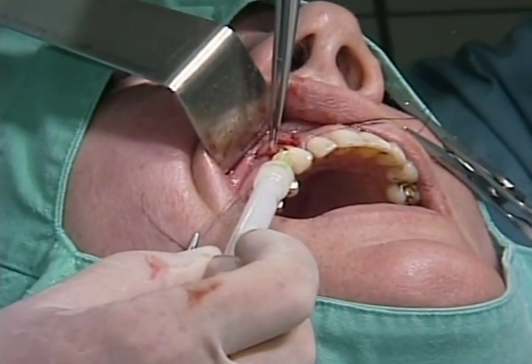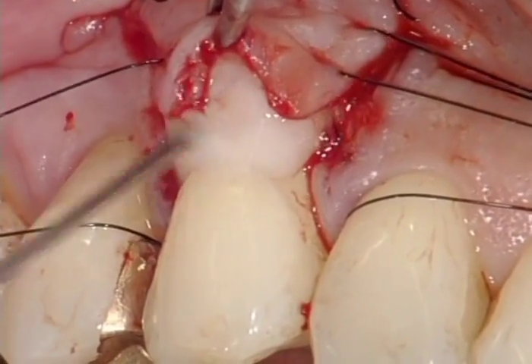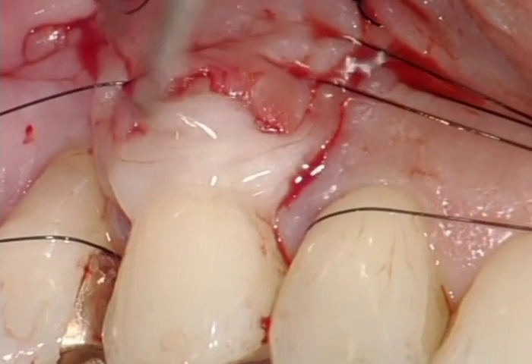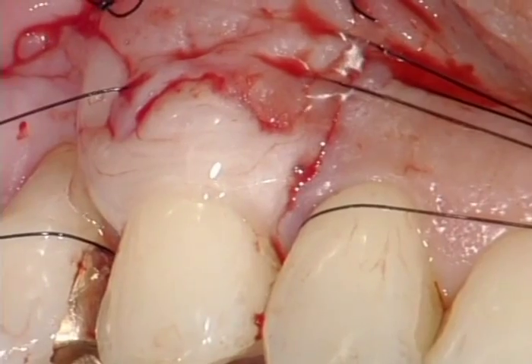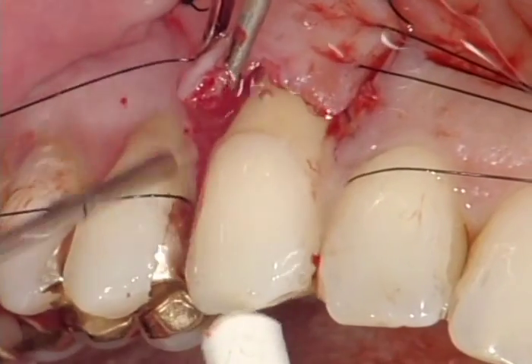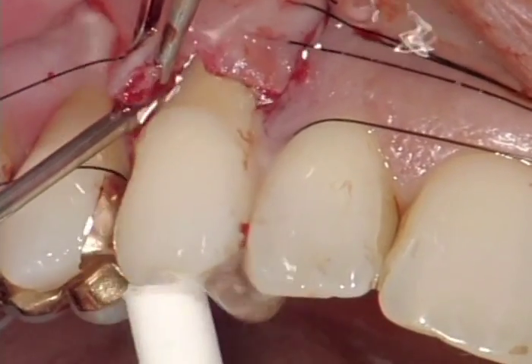PREF gel is applied now. The needle is inserted directly into the defect and the exposed root surface is completely coated with PREF gel. The smear layer is removed by conditioning the complete root surface with PREF gel for two minutes. After two minutes, the site is rinsed again with sterile saline solution. All contact with blood or especially saliva on the root surface should be avoided.